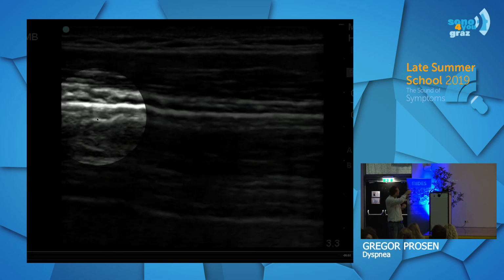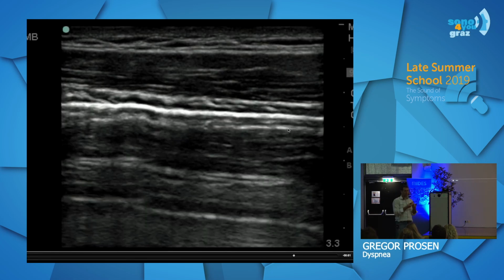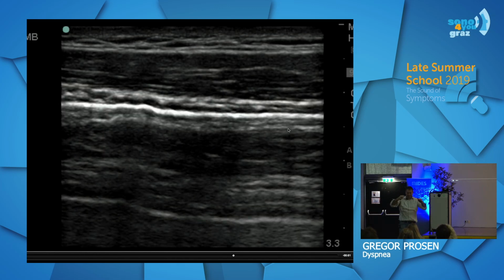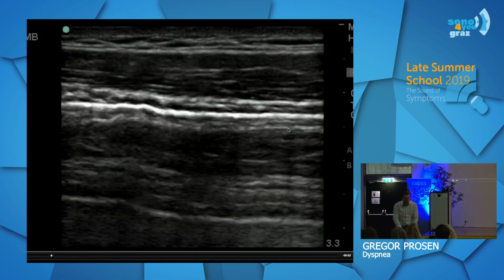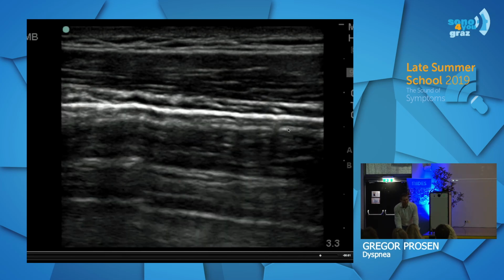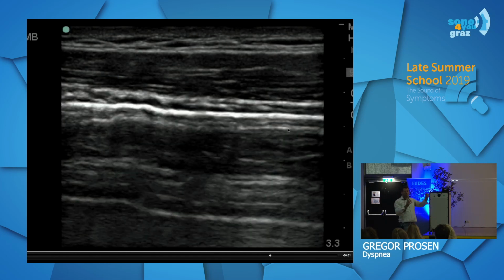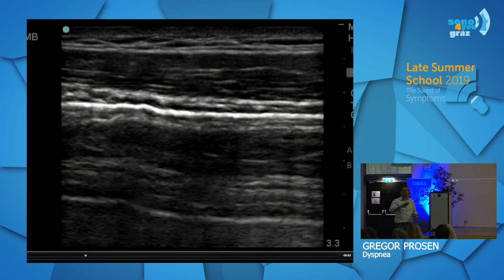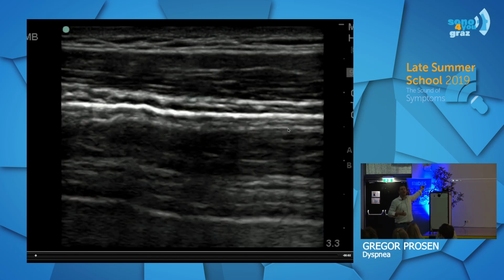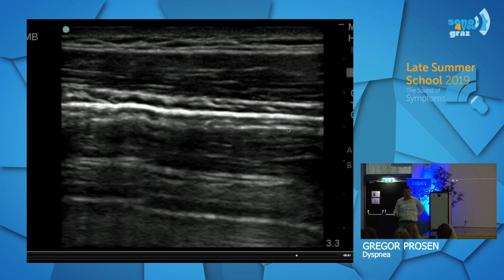Because the pleura, in this case this one, is very hyper-reflective for our ultrasound, right? What is hyper-reflective? The ultrasound goes through the muscles and comes to the pleura, boom, and there is nowhere for it to go because it cannot go into air. So all this ultrasound comes back. That's why it is so white. But if I also showed you ribs, then you would be 1000% sure this is the pleural line, and there is no pleural sliding, no lung sliding. Yes? So correct, your answers were correct.